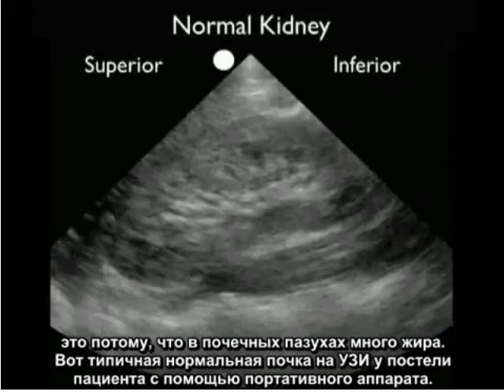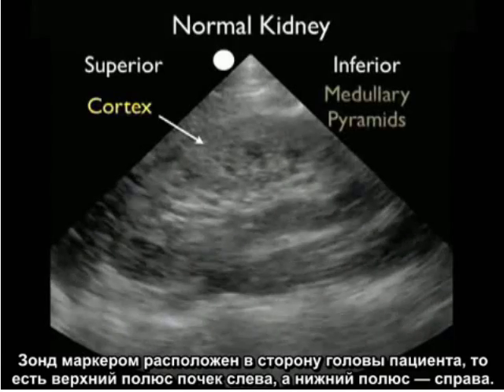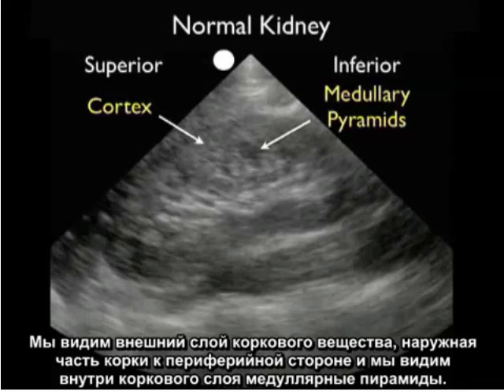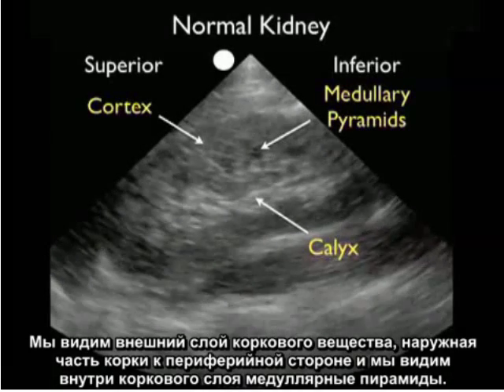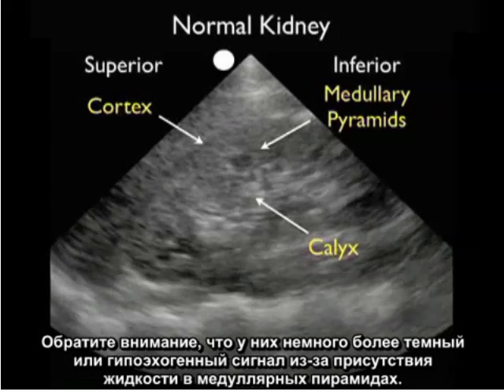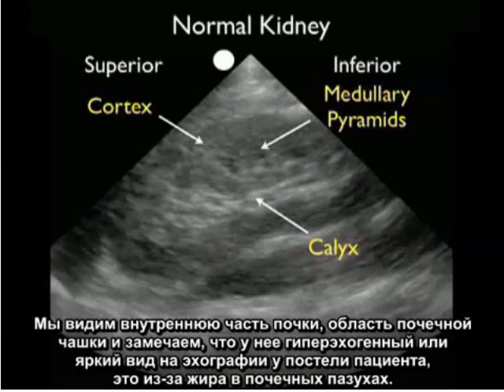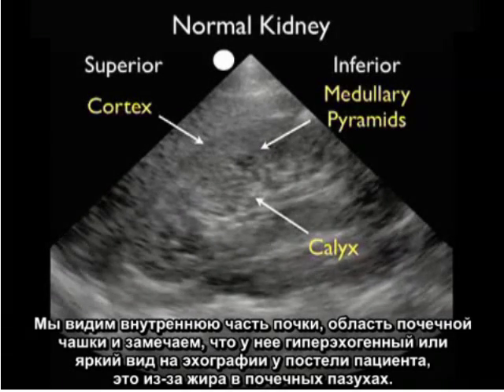Here's a typical normal kidney on bedside ultrasound. I have the probe marker oriented towards the patient's head, so superior pole of the kidney is to the left, inferior to the right. We see the outer cortex, that outer rim of kidney, to the peripheral aspect, and we see just interior to the cortex, the medullary pyramids. Notice that they have a little bit of a darker or hypoechoic signature due to the presence of fluid within the medullary pyramids. We see the inner part of the kidney, the calyceal region, and notice that it has a hyperechoic or bright appearance on bedside sonography due to fat within the renal sinuses.